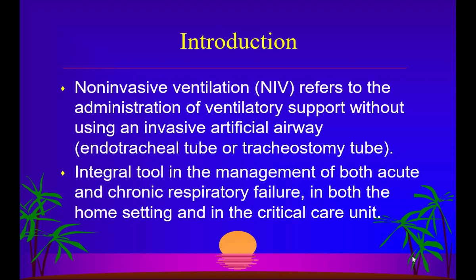It can be applied in ICUs, in the SDU, in the wards, and it can also be applied in home care. That's the beauty of it. A large number of patients are on non-invasive ventilation at home. Many times even the patient's attendants can be trained in using it. So it is very, very simple to use, but it has to be used very, very appropriately.